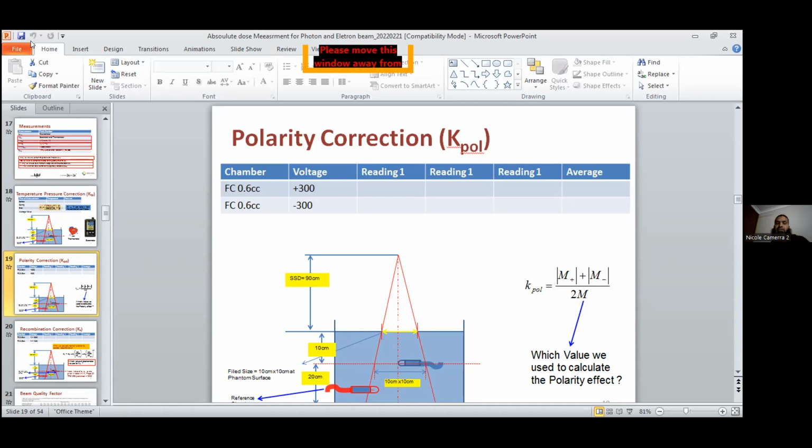if you read the tech doc 1273, I think. Does anyone remember it? I remember the 1273 tech doc, which actually explains why you shouldn't be doing the polarity correction, because it's a sensitive issue.